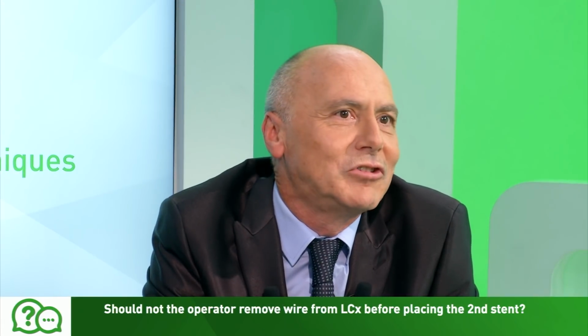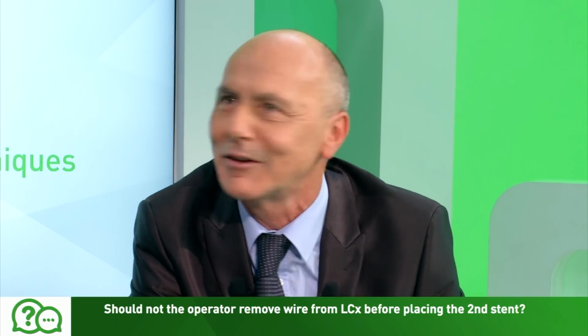Of course, this is an option and it's completely acceptable, because the stent in the circumflex already secures the patency of the ostium. I learned to do it this way in the past, and since I didn't have problems, I'm not changing things.